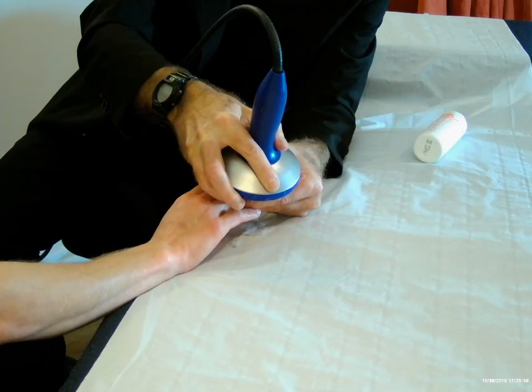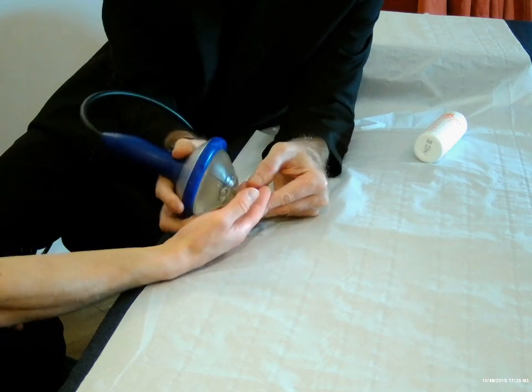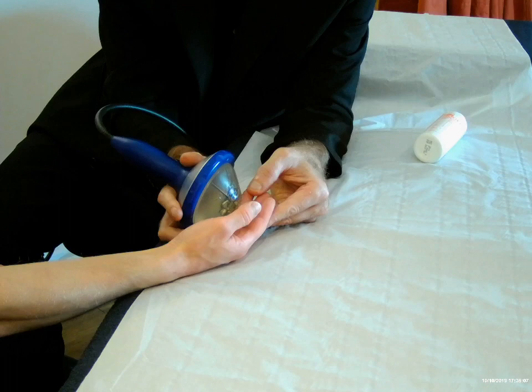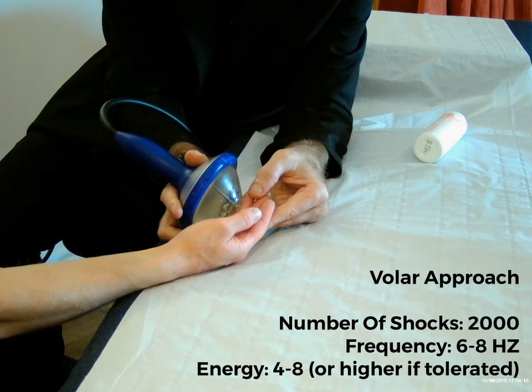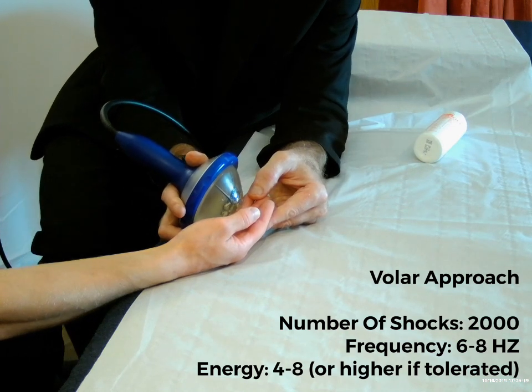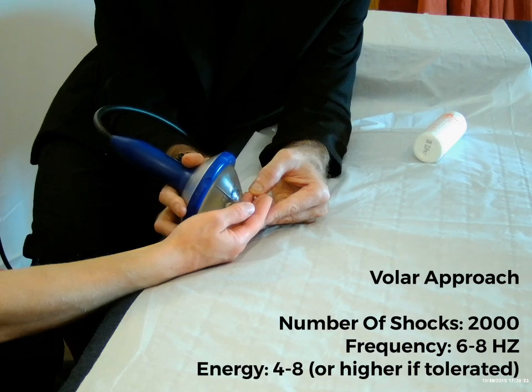So we've performed 2,000 pulses with the palm down. Can you just turn your palm up now? We're going to now decrease the power because we're going for a different angle. We're hitting the same tissue, but just from a different angle. We're making sure we're covering every possibility to try to optimize the benefit of the treatment session. We pretty much expect that we're going to be turning it up fairly quickly, but we don't actually know, so we have to monitor things again.